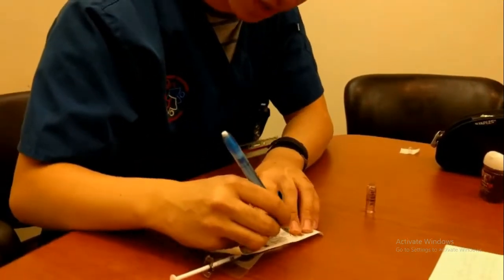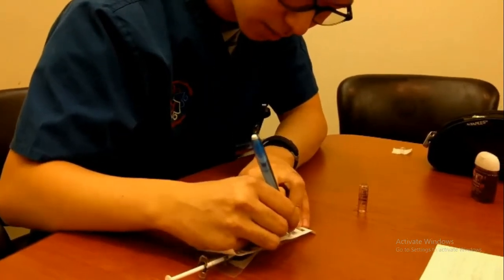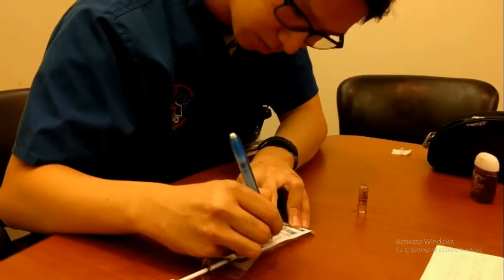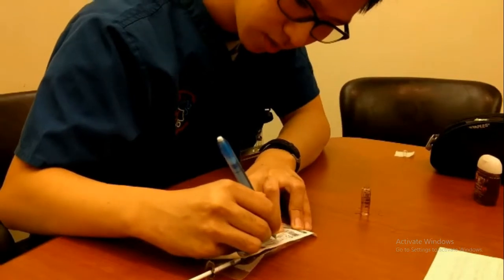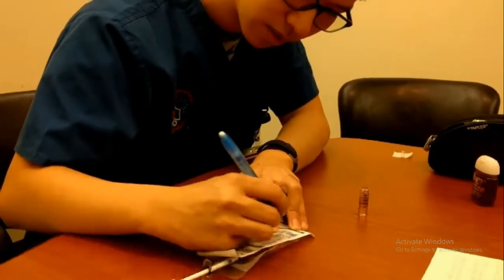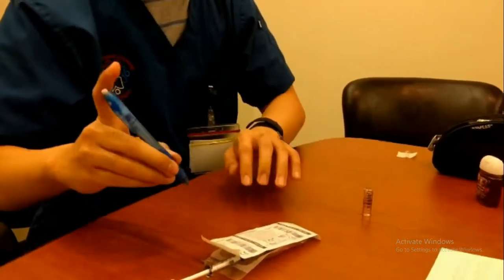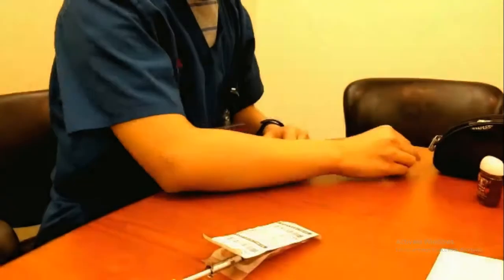I'm going to be putting it into the paper and writing the room number 701, bed 1, Mr. Mancini, Mario, January 15th, 2017, and my initials. And I will also be putting this vial in the sharps container.